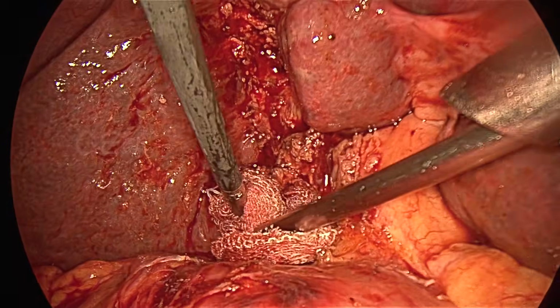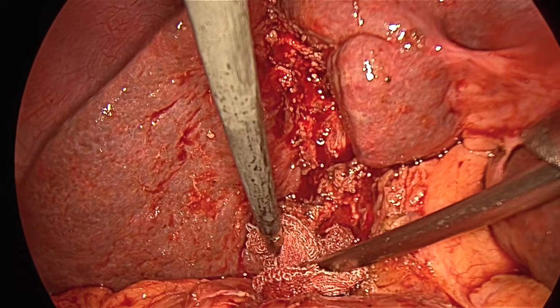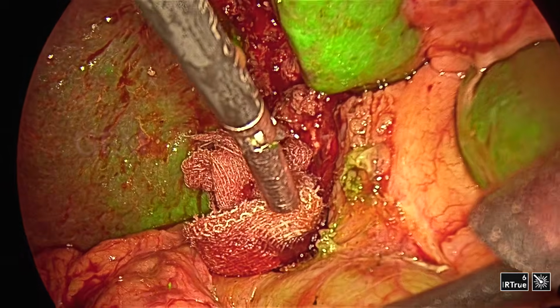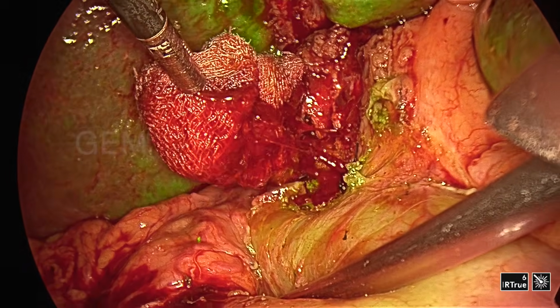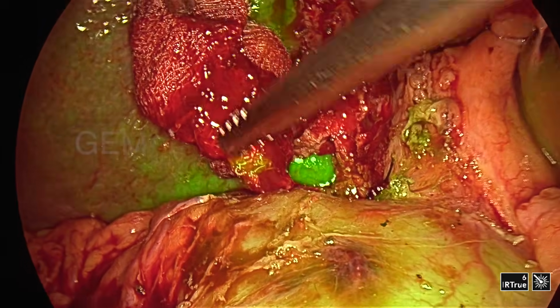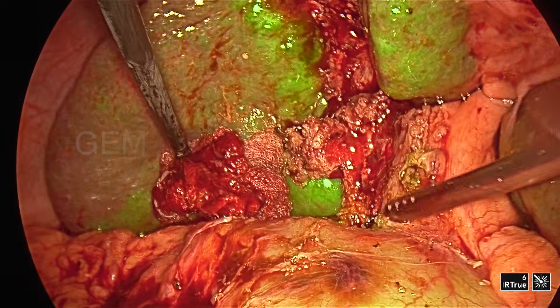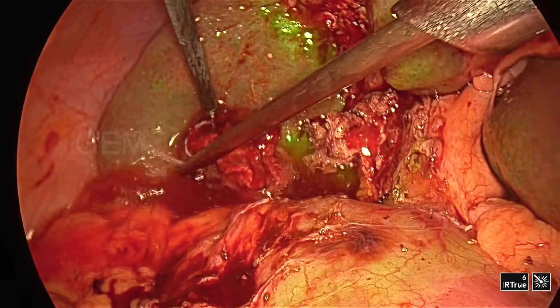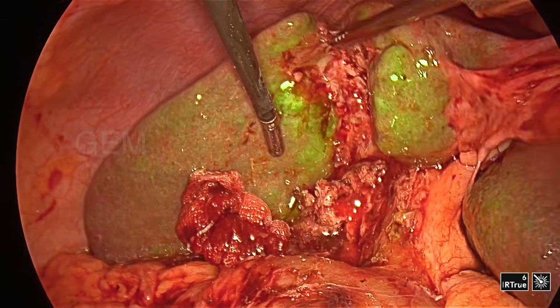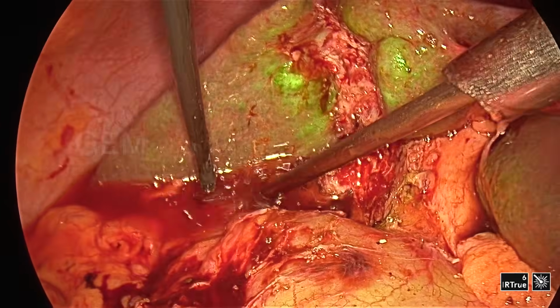So now I am just checking the gauze piece, sucking it out. I made it into IR mode. Can you see the intensity of IR mode is a little less compared with previous. So now you can see there is nothing there. There is no bile leak. So it is completely closed. That means after 20 minutes or half an hour, there is no bile leak.